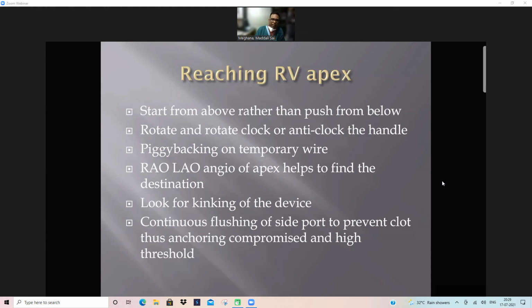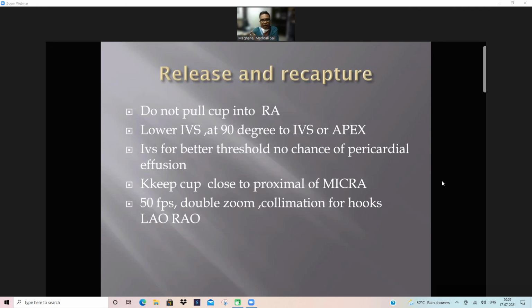And if you have a temporary pacemaker, that will work as a kind of lighthouse. It will guide the Micra on the outer curvature of your temporary pacemaker to the spot, where it is very easy if you have a temporary pacemaker. Now, if you have pre-existing leads or tricuspid valve implantations, mechanical valve, you should avoid. If you have other valves like tissue valves or ring, this is not a problem.